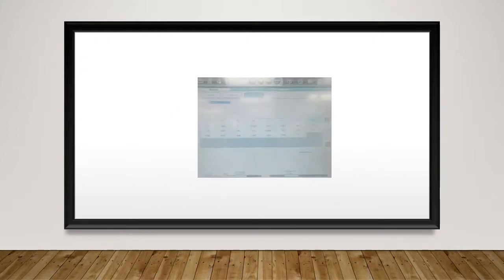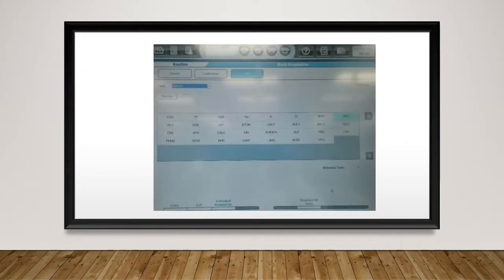Here's a quick tip. To request QC panels for validation or evening-night QC panels, select the Profile button after selecting Start Entry. Then choose the respective QC and close the pop-up window. That's it. Just don't forget to select Entry to save your settings.